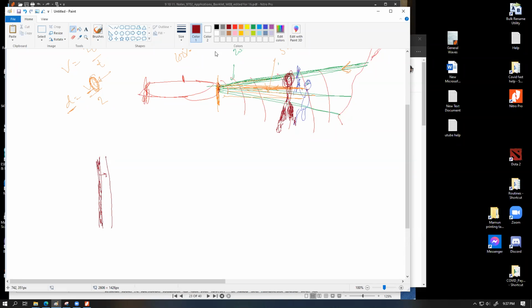Let's say after the skin we have a bit of fat. If you wonder, we don't have fat everywhere, but we have fat in most places, more or less. So consider that this is fat. Beyond the fat, typically we have flesh, muscle. So let's say we have a layer of muscle. Beyond the muscle, we have the actual physical structure. Now, a very easy example to deal with is the thigh, because the thigh has a single bone, the femur, and there is no open space like the stomach or lungs where we have to deal with actual air cavities. So consider the thigh for a simpler representation.